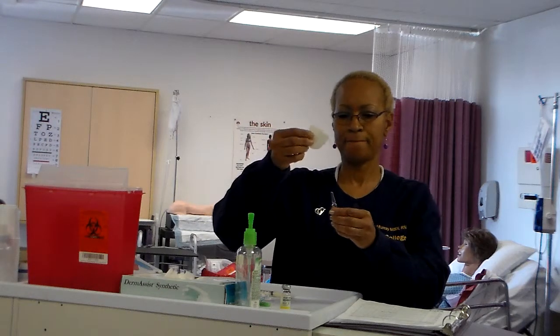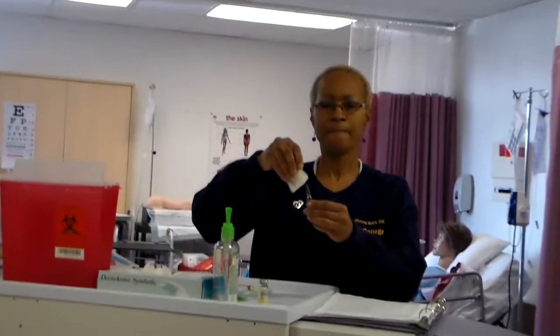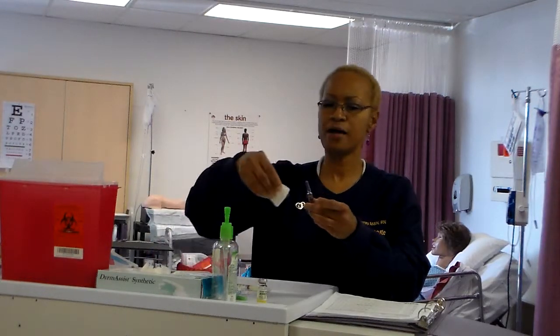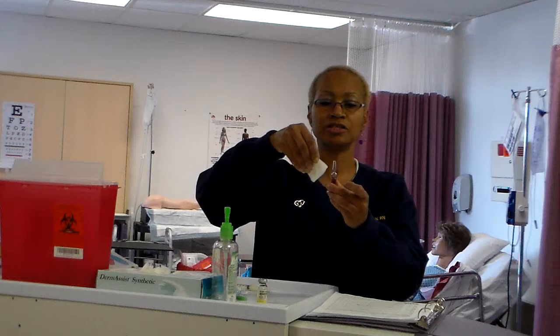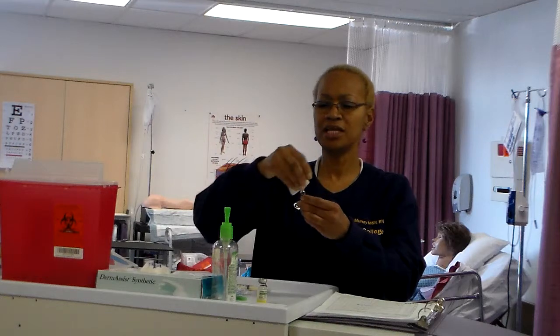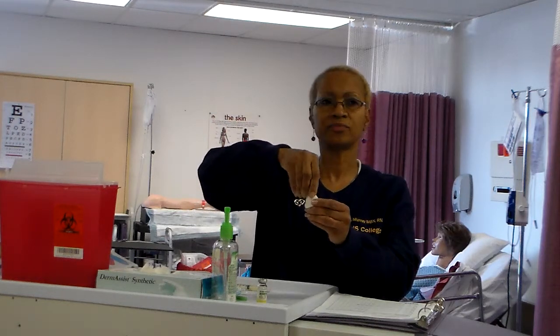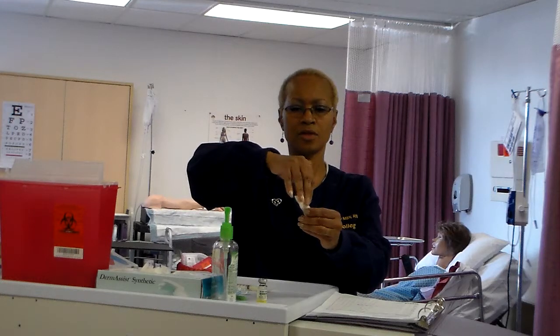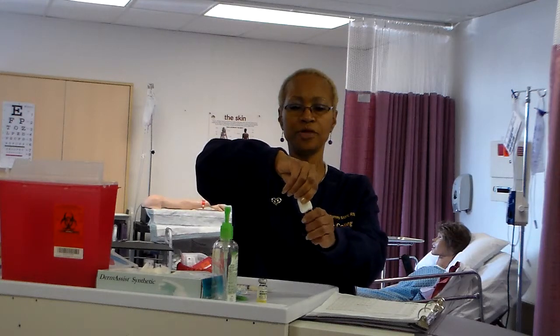Place a small gauze pad or unopened alcohol swab around the neck of the ampule. I prefer the gauze rather than an alcohol swab. Just make sure that it's large enough to cover the scored area so you don't cut your hand, because sometimes it breaks off very jagged and you'll cut your thumb and it gives a really ugly cut. Snap the neck of the ampule quickly and firmly away from your hands. So you're going to snap it away from you.